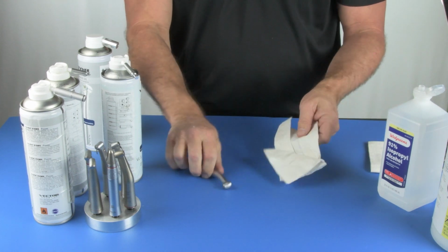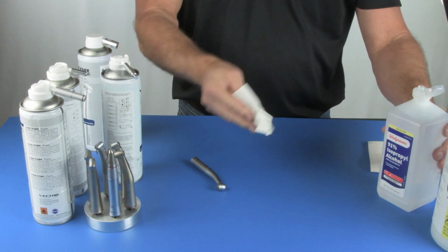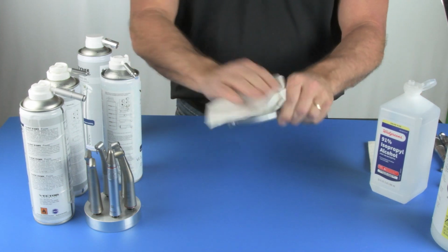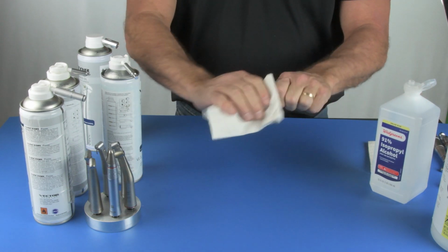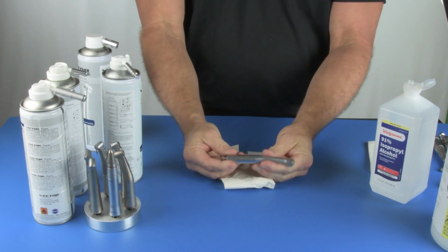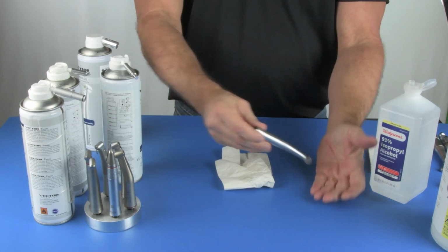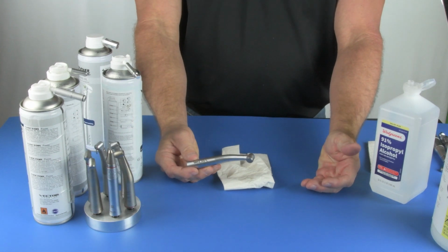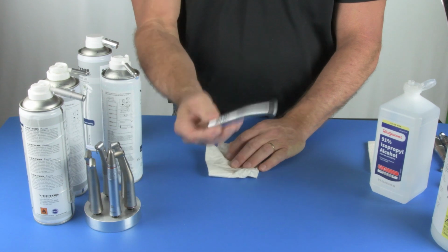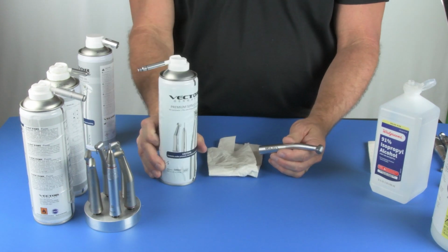After that, take an alcohol 2x2, again, damp but not dripping, wipe the exterior of the handpiece. This will remove 99% of the oil off the handpiece. Bag the handpiece, or don't bag the handpiece depending on how your office proceeds, and after sterilization the handpiece is ready to go. You do not need to re-lubricate with this particular type of oil.